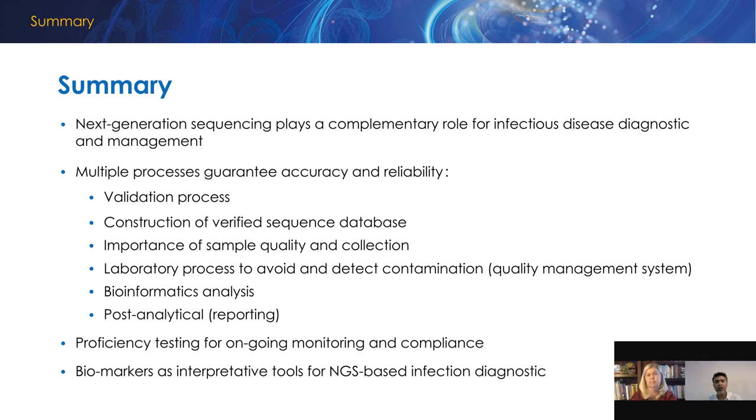The other important point is to make use of biomarkers or just simple indicators of possible infection. One of the best examples is, if people want to do NGS from a urine sample, that can be a little messy with all the organisms, but a well-collected sample, a catheterized sample, used in conjunction with urinalysis can provide information beside the clinical presentation. So these will be important variables to take into consideration: the clinical picture, any presence of biomarkers, and the result itself.